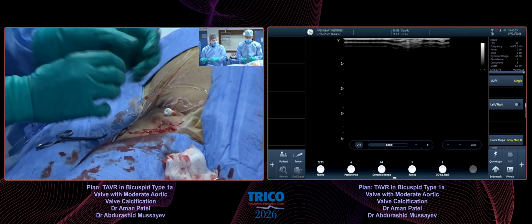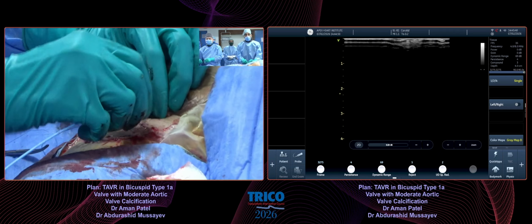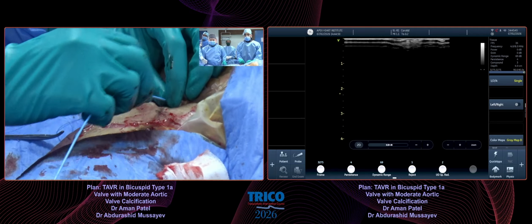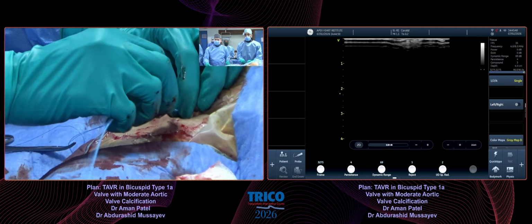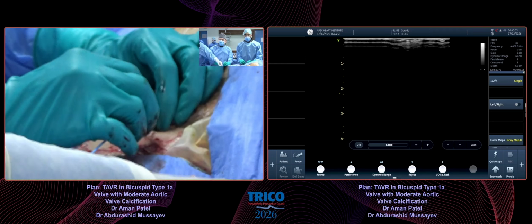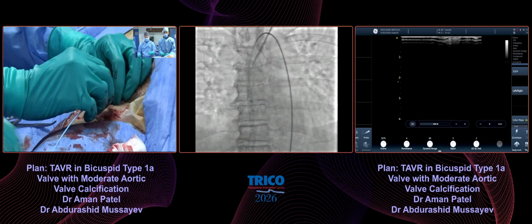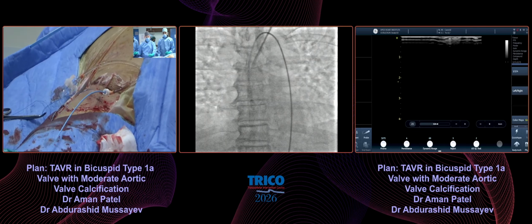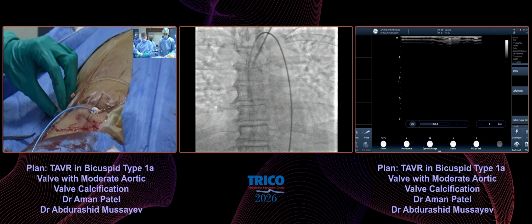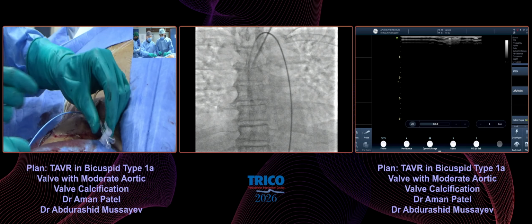If it is on the head of the femoral, I think you can be very, very confident. But very often if it's above, even in my center, we use 2 ProGlides, not an Angio-Seal. Some of the operators do choose one ProGlide and one Angio-Seal. But we feel any suture-based closure gives you great freedom to re-access as early as possible. That is also my reservation against the Angio-Seal, because it invariably changes the vessel wall morphology after use.